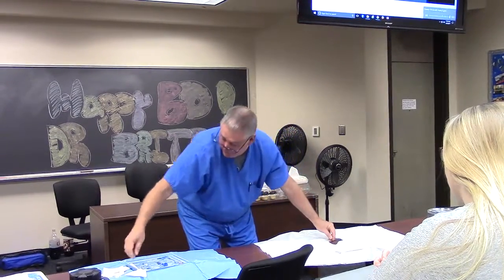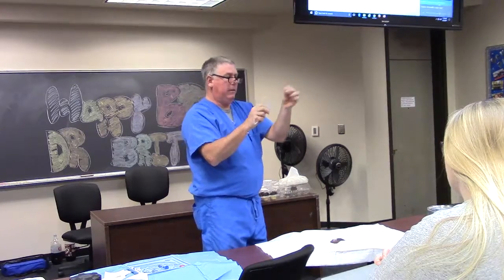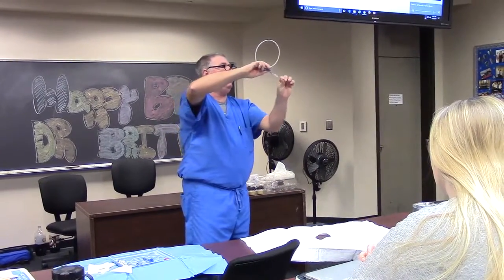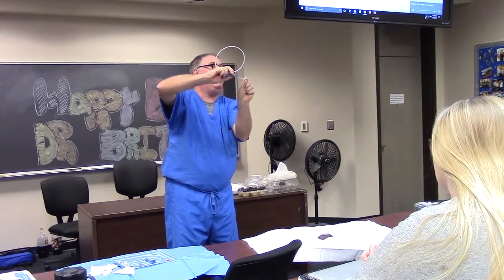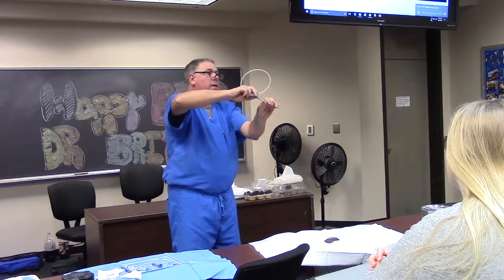Okay? Now you simply take your J-wire, like that, and this right here fits over the hub. And this thing comes off, by the way, like that. So you've got to kind of watch out so you don't separate things. All right. I'm going to take this and stick it over the hole, put it in the introducer. I need one more hand here. Put it in the introducer needle, and then I'm just going to use my thumb to start advancing the wire. And you see the wire comes out the introducer needle. And now you're going to put it in until you get to the mark. There's a mark on the wire right there. You see that dark spot? Okay, so we're going to get the wire in to our desired depth. That's 10 centimeters right there.